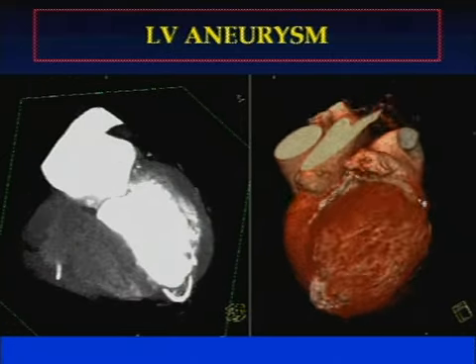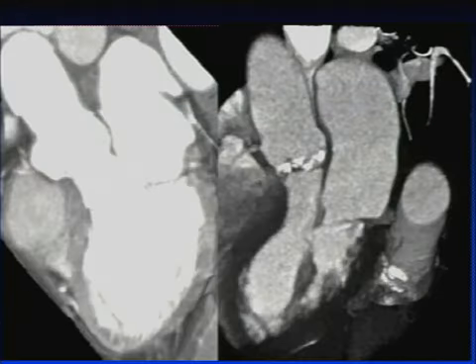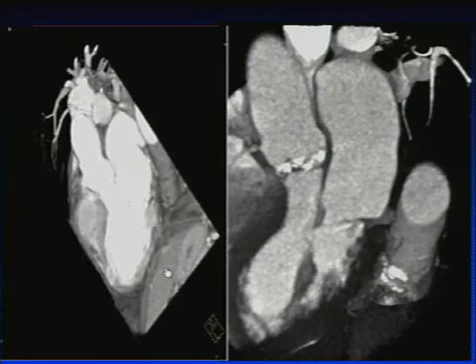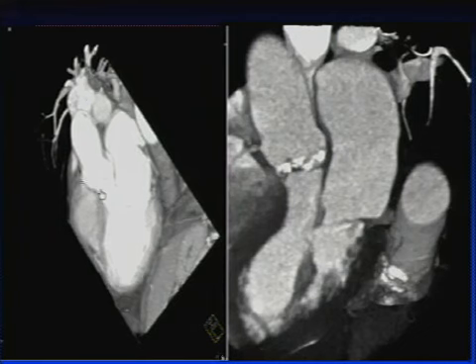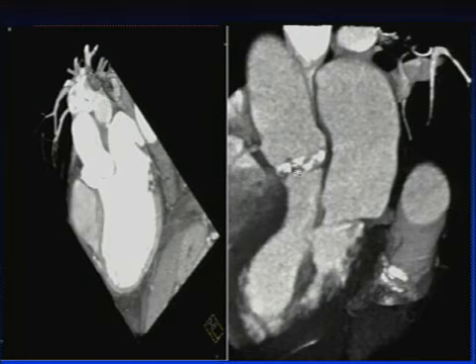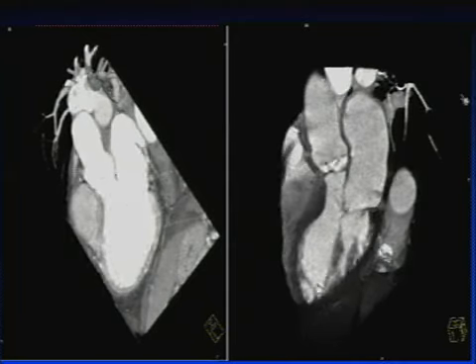So whenever we do coronary imaging, we do 4D CT. You can also look at function using 4D CT. And we look at both myocardial contractility and look at the valves. And this is a normal aortic valve. You can see the valve leaflets opening and nicely coapting. And contrast that to this patient where you can see calcification along the aortic valve. This patient had a functional bicuspid valve, and you can see the restricted motion here of the valve leaflets.